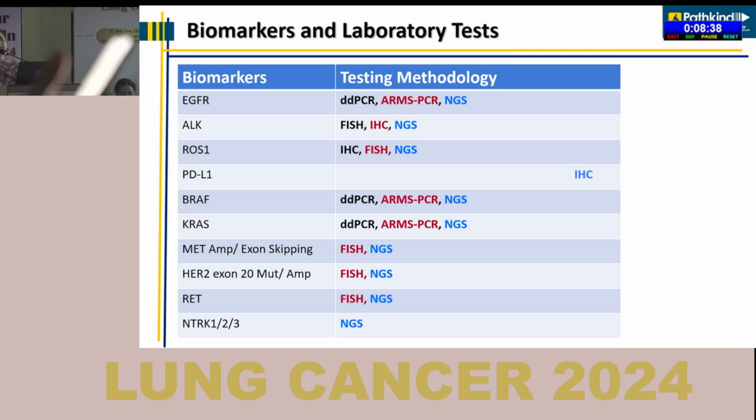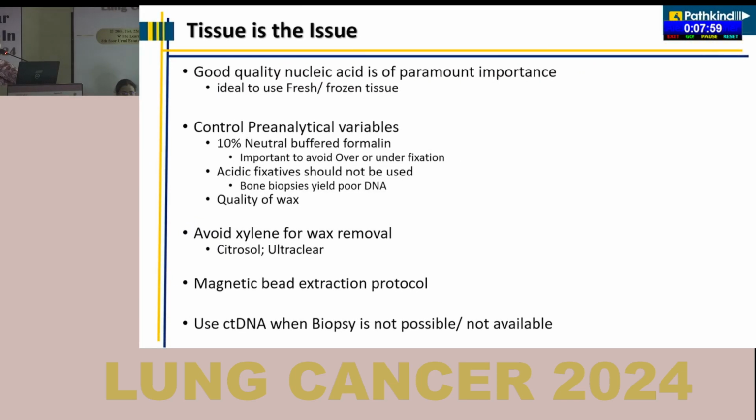In line with that, in our laboratory, most of the testing that we do is NGS panels. Having said that, we are not limited to NGS as a standalone laboratory. Depending upon the patient requirement, we also do specific standalone biomarker testing using either ddPCR, ARMS-PCR, FISH, or IHC. An important case in point is PDL1. As of right now, at least in our laboratory, we are offering PDL1 testing only on the tissue sample, so just the IHC based.